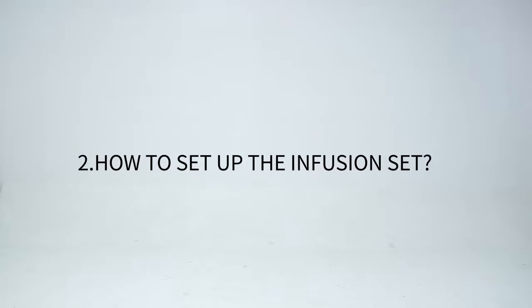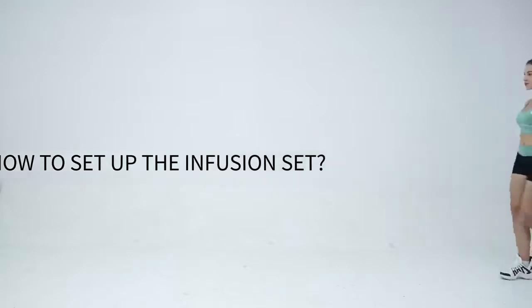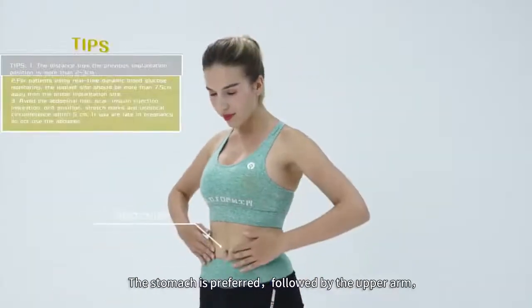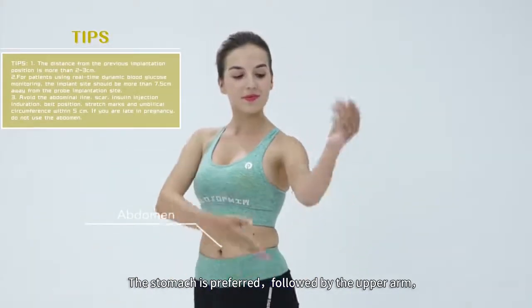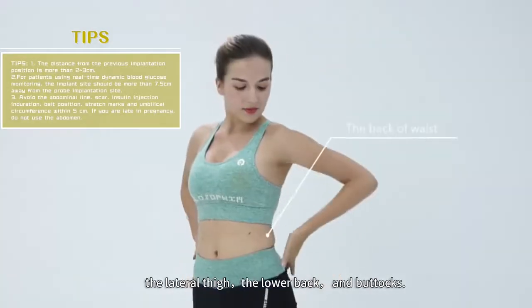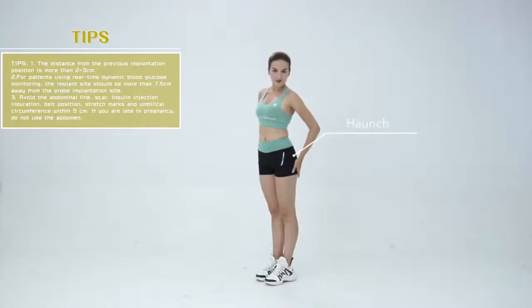2. How to set up the infusion set? Choose an appropriate place for the infusion set. The stomach is preferred, followed by the upper arm, the lateral thigh, the lower back, and buttocks.